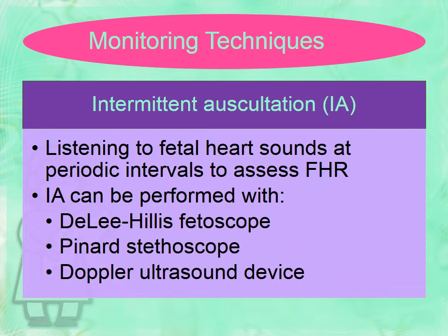In order to accurately check the fetal heart rate, the nurse should palpate for contractions, begin listening at the beginning of the contraction, and continue to listen until after the contraction has completed. When the nurse spends this amount of time assessing the fetus, the nurse will need to remain at the bedside. This requires a 1-to-1 staffing ratio. At the point that 1-to-1 staffing cannot be met, the patient will need continuous external fetal monitoring begun.